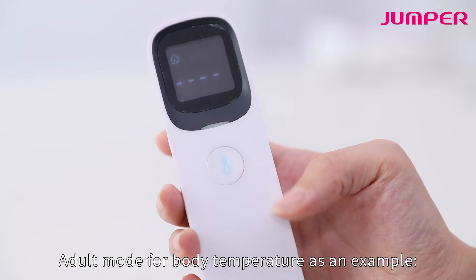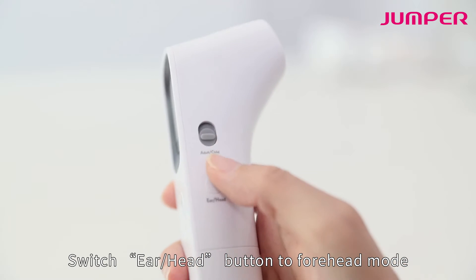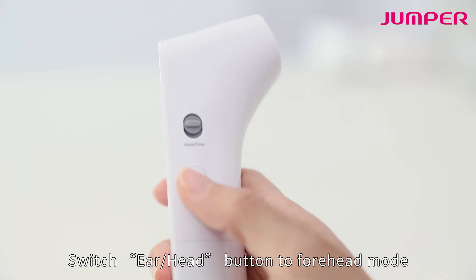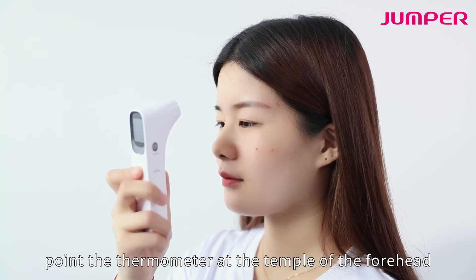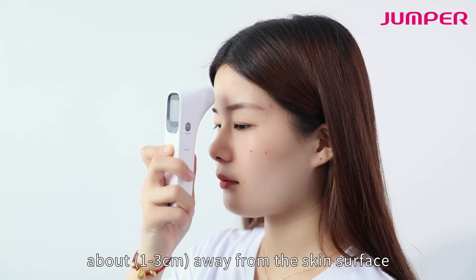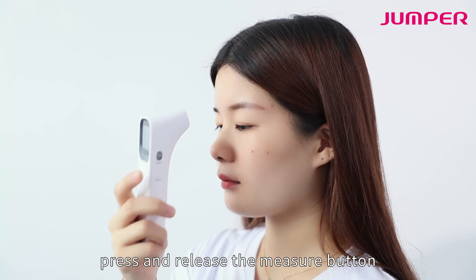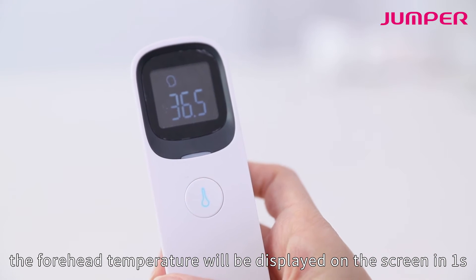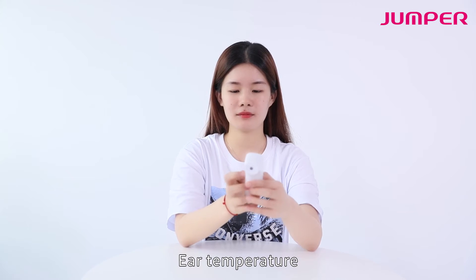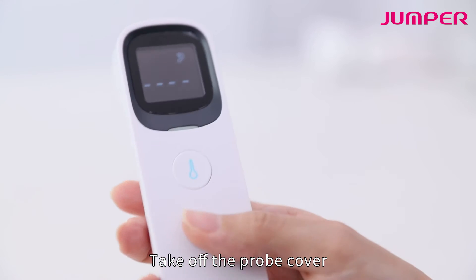For forehead temperature, switch the ear/head button to forehead mode. Point the thermometer at the temple of the forehead, about 1 to 3 centimeters away from the skin surface. Press and release the measure button — the forehead temperature will be displayed on the screen in one second.